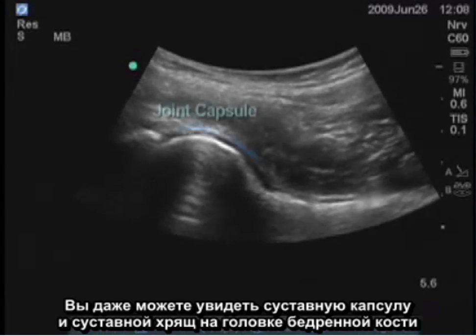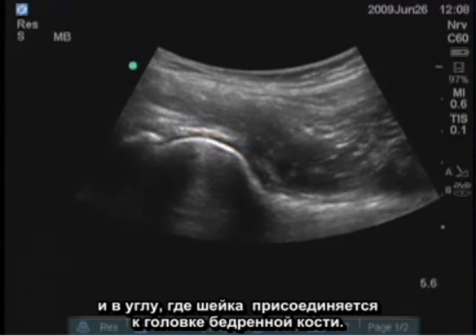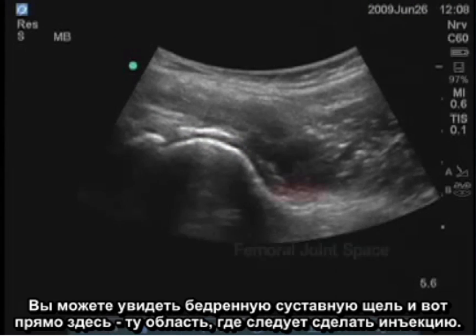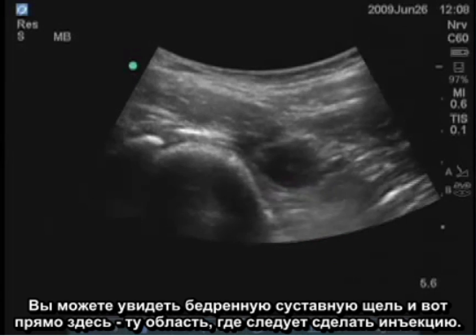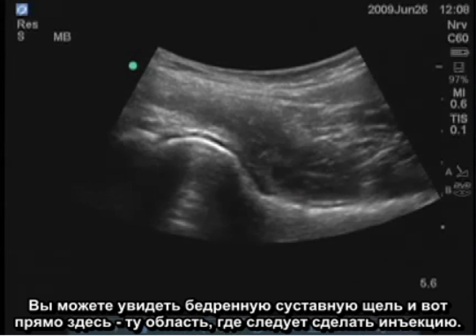You can even see the joint capsule and the cartilage on the femoral head, and in the corner where the neck joins the ball of the femur, you can see the femoral joint space. And that area right there at the base is where you aim when you want to do an injection.